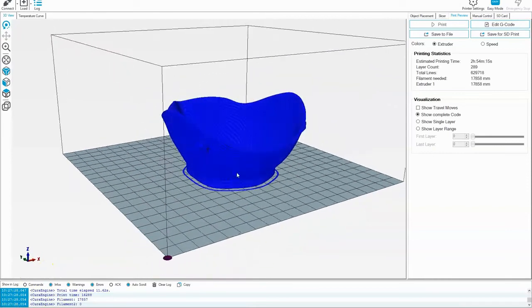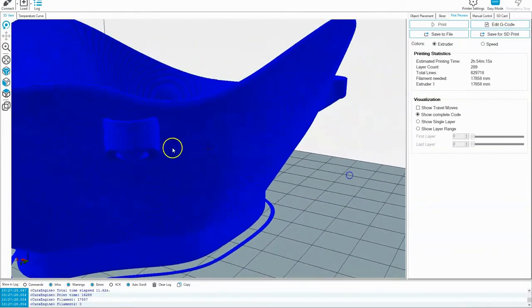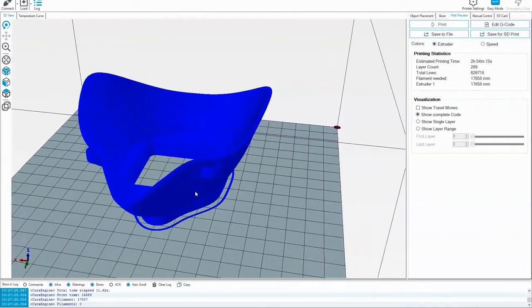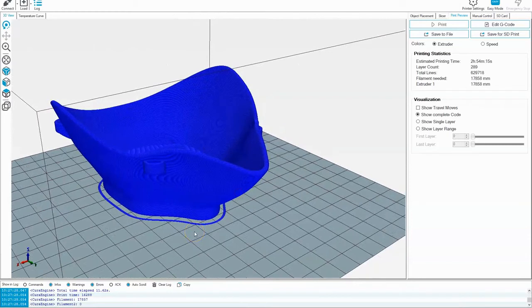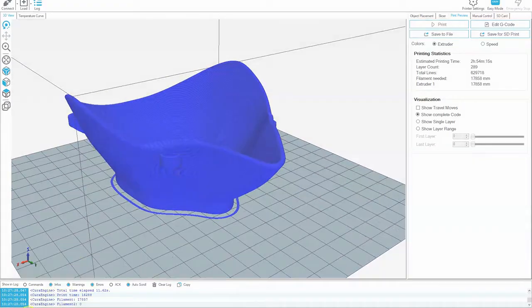All right, so there is the layer structure set up. If I zoom in, you can take a look at those and see some of those layers, and that looks like it's good to go. So I'm going to go ahead and start the process to export this to one of the small export cards. These are the mini SD cards, and then we'll take this over to the printer.